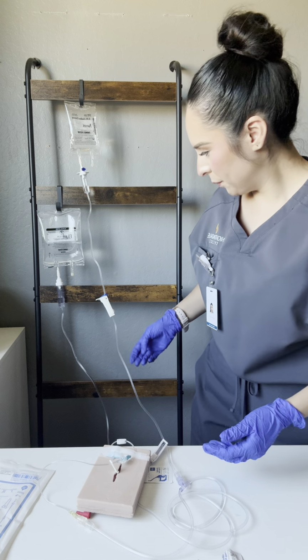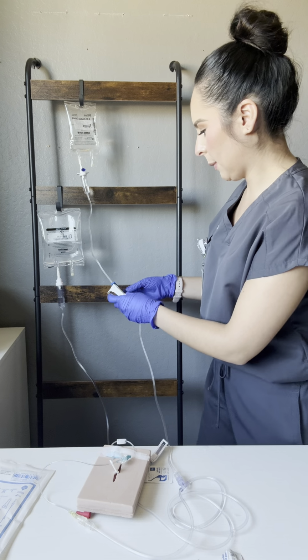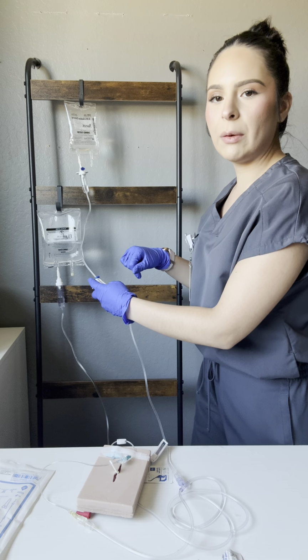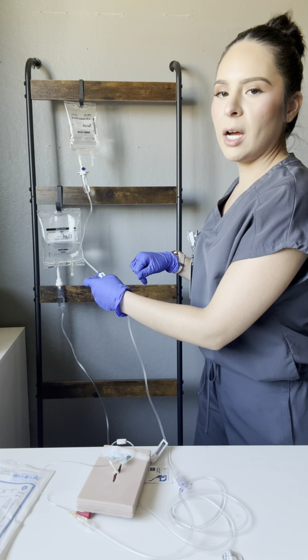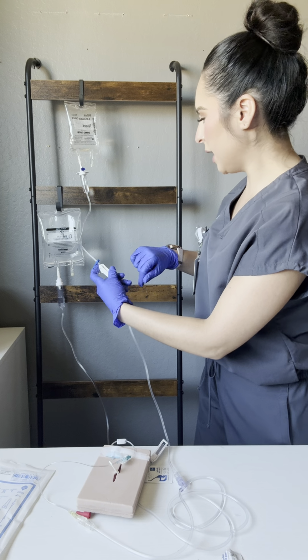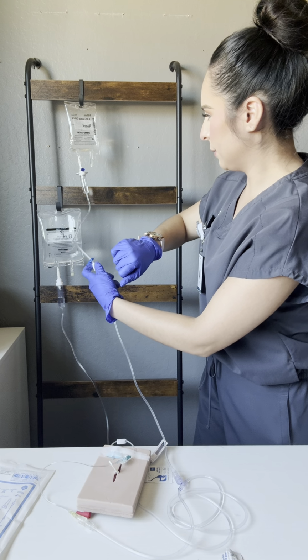And now we're going to want to adjust our flow rate. So for our amoxicillin, we want to make sure that we are administering 100 drops per minute. So we're going to slowly roll up on our roller clamp and then count for 1 minute.